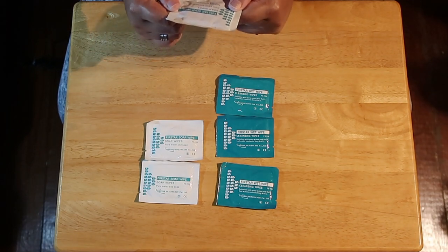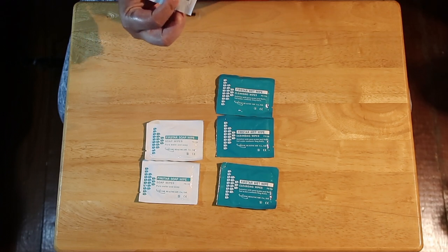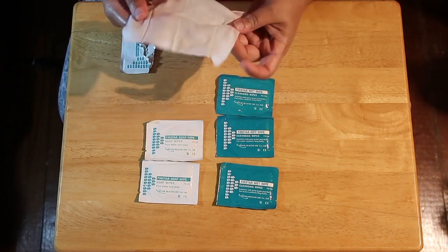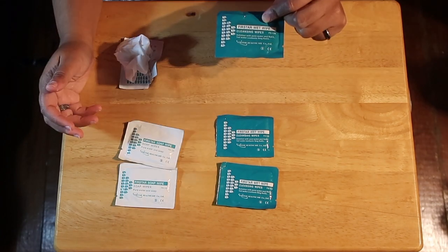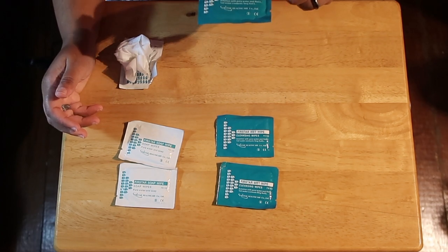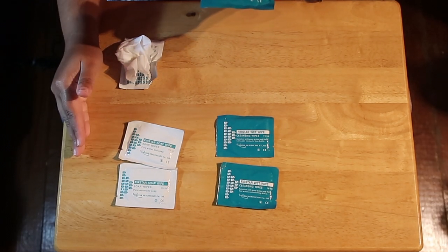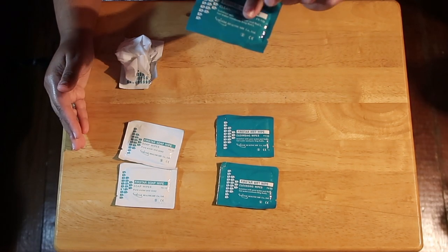This is soap wipe. Pure water and soap. Expired 2012, January of 2012. I guess it smells like wet ones, just like watered down wet ones. This is a wet wipe. Cleansing wipe solution with water and NaCl. NaCl is salt. 1 milliliter water contents for 9 milligrams of salt. So this is just like saline wipes essentially.